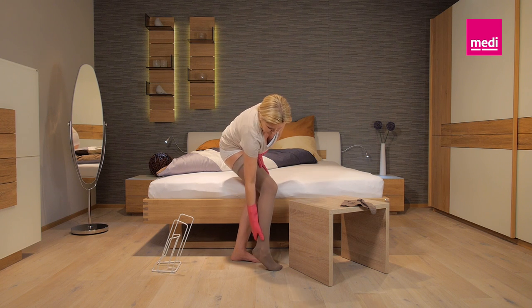By the way, Medi-Butlers are very simple to care for. You can wash them with standard cleaning agents and disinfectants.